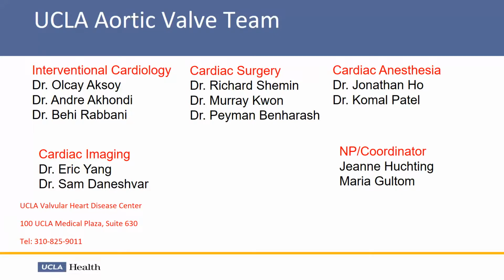One, if you have a small annulus. It's simple, bring back pi r squared. If we measure the aortic valve area, it's 314, you do the pi r squared, the diameter is going to be 20, and the radius will be 10. If you have somebody who has a tiny aortic root and a tiny aortic annulus, you really don't want to put a tiny valve in because you're going to get patient-prosthesis mismatch. CoreValve would be a great valve for that, because then you have a higher supra-annular valve, and you're going to get more of an effective orifice area. That's one particular use.